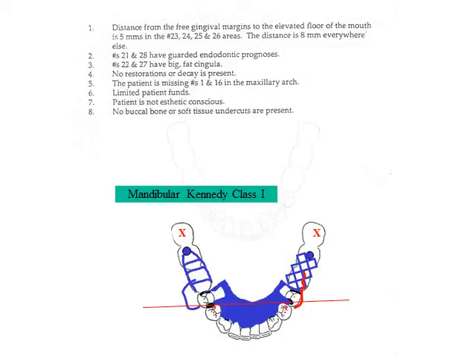Tissue stops should be present on the casting, and is the only area which touches soft tissue. If not, they may be added with cold cure acrylic. This RPD has been designed to best support the primary abutments from trauma, as well as to facilitate a repair if any teeth are lost.